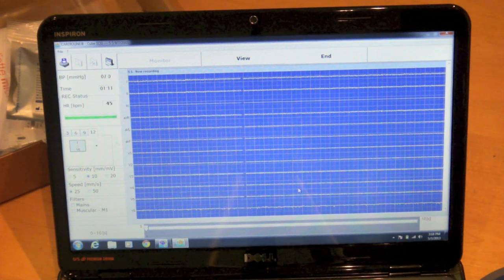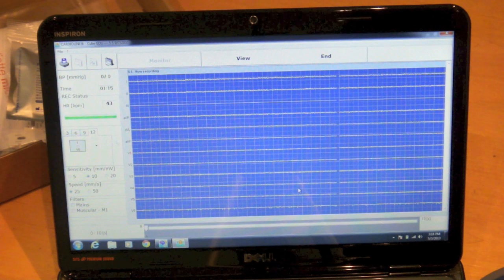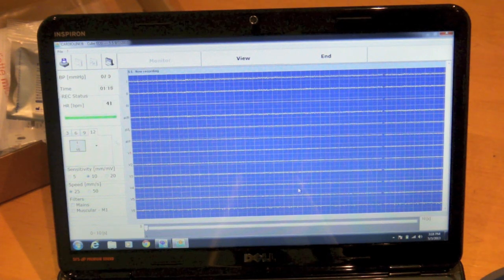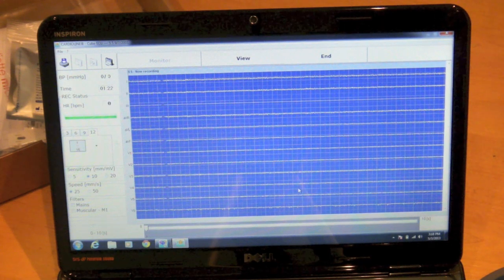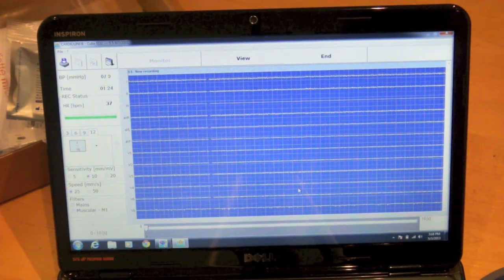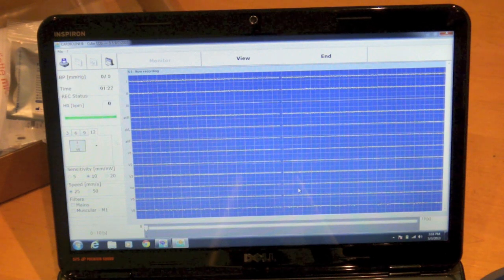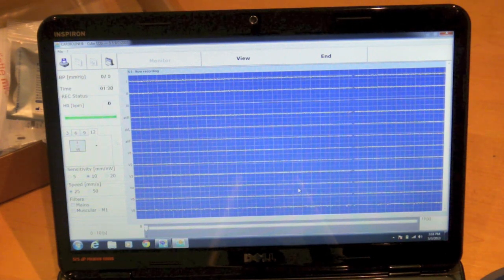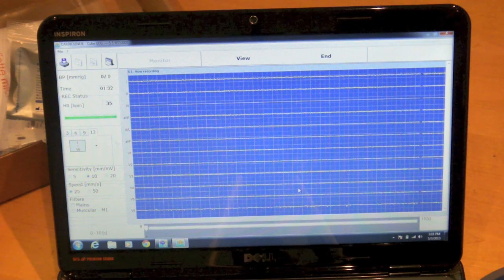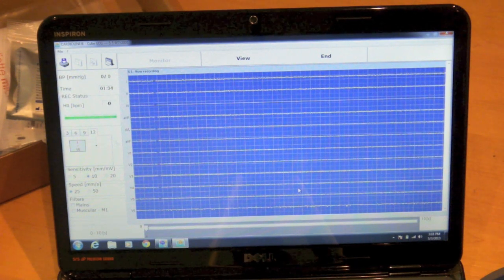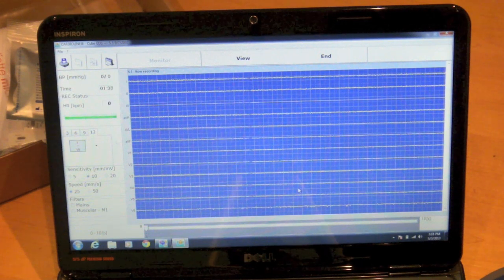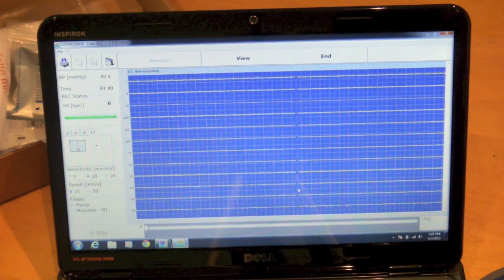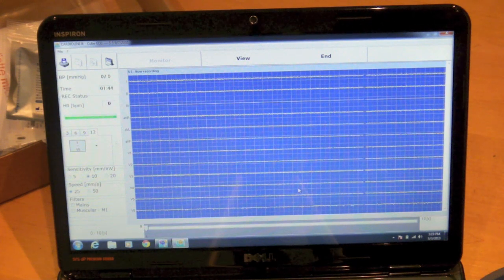Alternately, if you wanted to use the device away from a computer as a standalone 12-lead EKG, you can do so. You put the device into digital ECG mode, take the test on the device, enter the patient data or simply the ID of the patient. Then at that point you can take a full test, save it in the internal memory of the device, and upload it at any point later to the Cardioline Cube ECG software suite to be converted to a PDF or saved to your EMR suite.